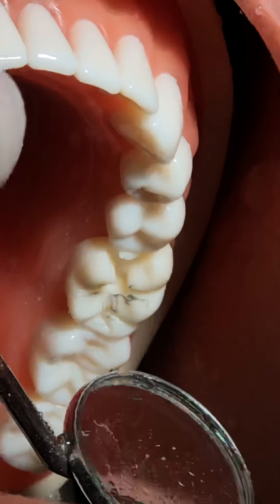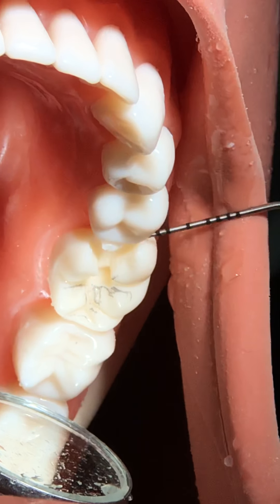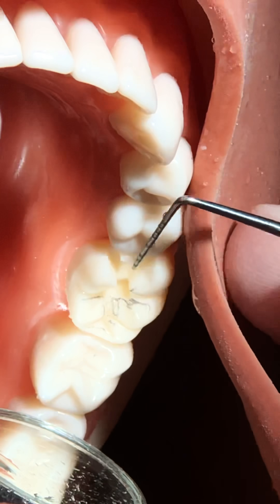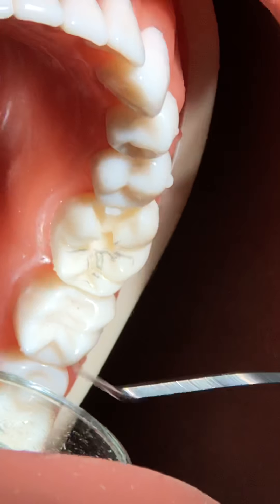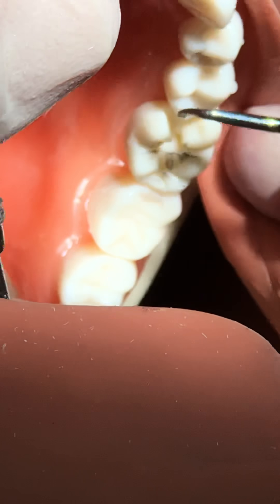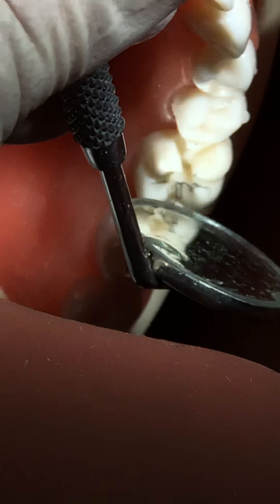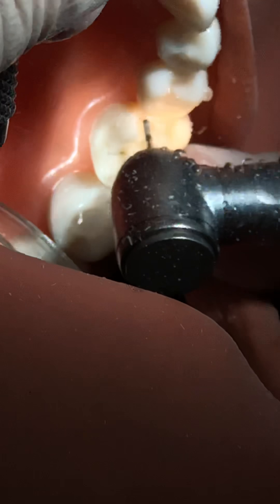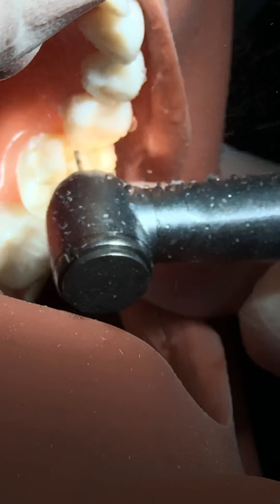The contact point is not broken. We have extended into the embrasures - this one is the buccal. You can check if you can remove the remaining ridge with an explorer or probe. If this were a natural tooth it would easily flick away, but this is plastic so it's very hard. We'll make it a little more - see the dimension of this small portion - that is enough for the natural tooth, but for plastic we'll remove a little more and make it smooth gradually, ensuring no extra cutting is done.